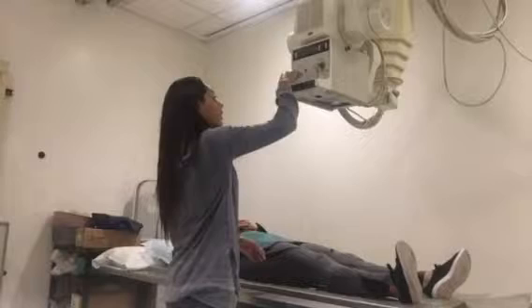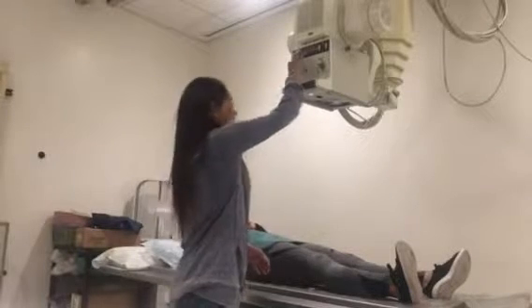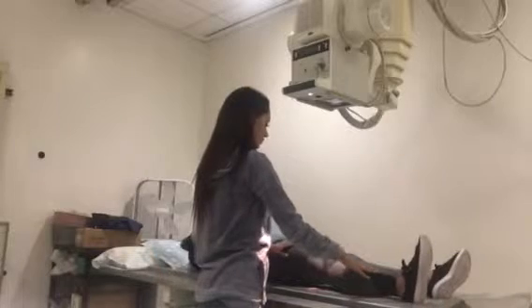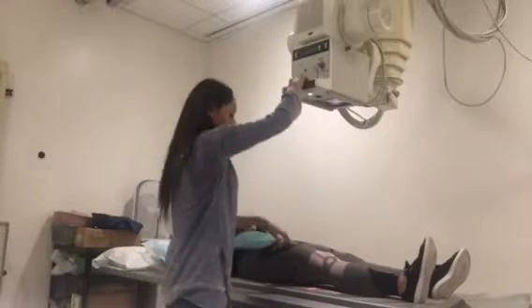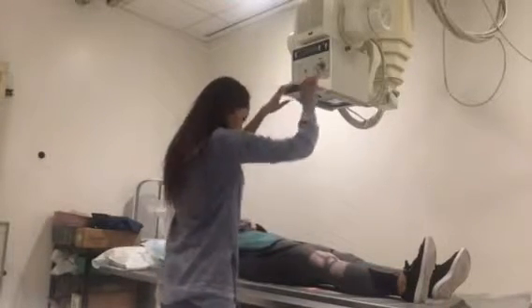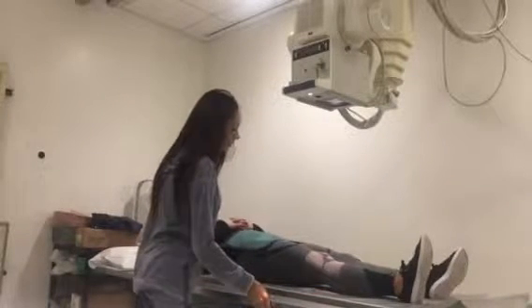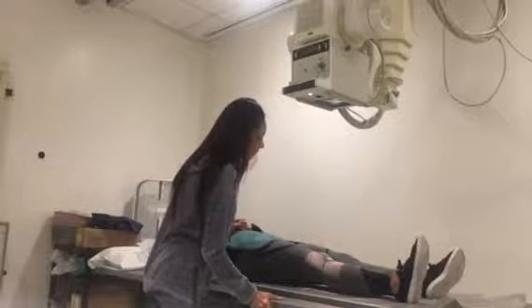So I'm going to go ahead and take the x-ray. X-ray, come back, and I would take my IR out, and then I would put a new one in. And this time I'm going to have my patient rotate their leg medially, 45 degrees. And then I have the same central ray, half an inch below the apex of the patella.